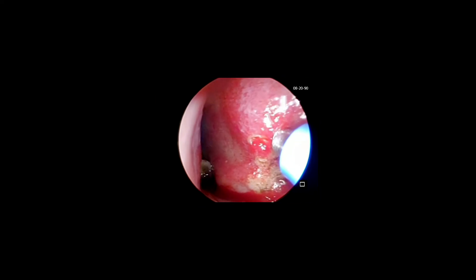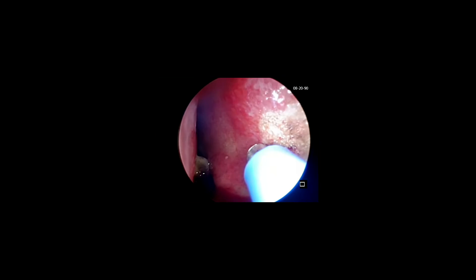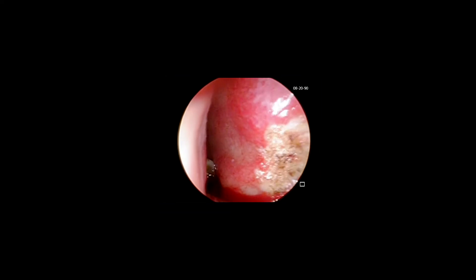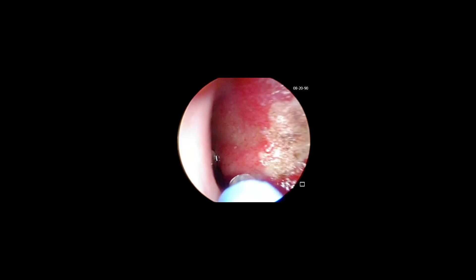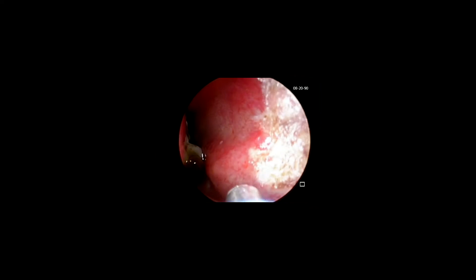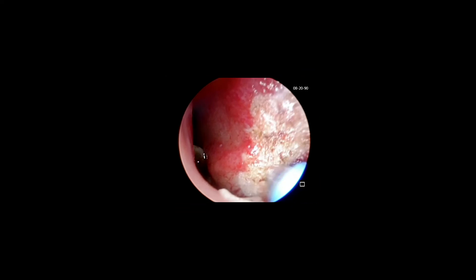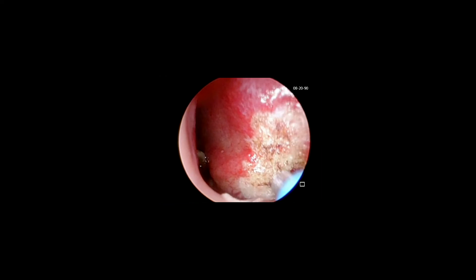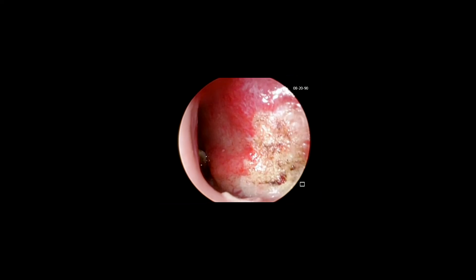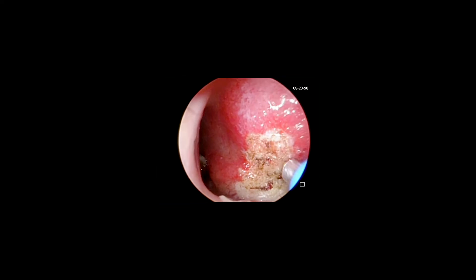As you can notice here, all throughout the front part of her septum — that's the wall that divides the left and right side of the nose — she does have quite a number of vessels. So it's not going to be just one bleeding point; we're going to make sure we get all the active sites and control the bleeding. Since she's actively bleeding, it's much easier to find exactly where the bleeding points are. Here are just a few more points. There are still some vessels even outside this area, and I'm going to show you a different technique to address that.